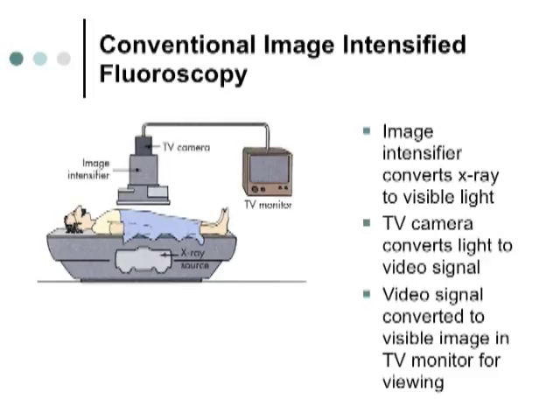That converts the light coming off of the output phosphor to a video signal which is carried to the television monitor. The television monitor also has a cathode ray tube. It has a filament and a cathode and an anode, which is the target, the actual screen, and it projects electrons to the screen, which is a phosphor which gives off light. So basically you're converting the radiographic image into a monitor image that you can visualize on the screen with the cathode ray tube.